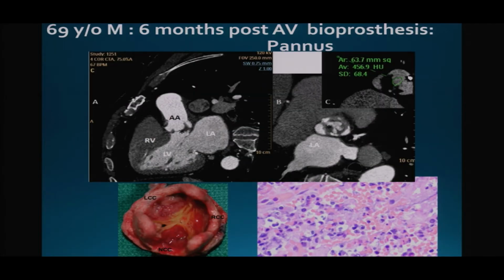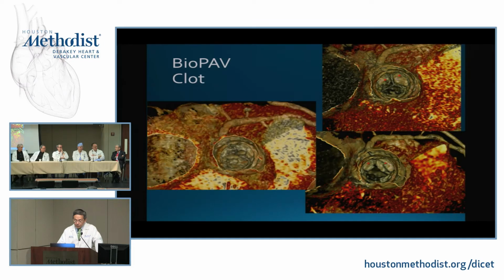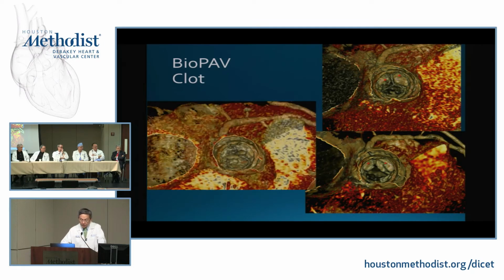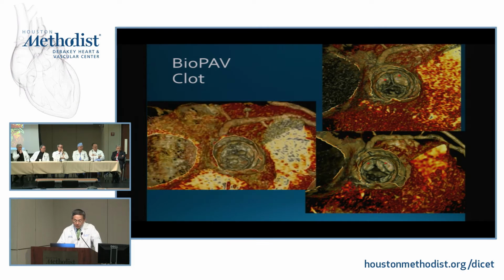It's another case of, I think this is Dr. LAWRIE's patient, a very accelerated failed bioprosthesis. Interesting case, 6 months after valve surgery, it has a tremendous amount of pannus in the biological valve, as seen here by the pathology, and also the explanted prosthesis. And this is becoming obviously our favorite test for our valve team, 4D CT. That's what they want, 4D CTA, there we go.